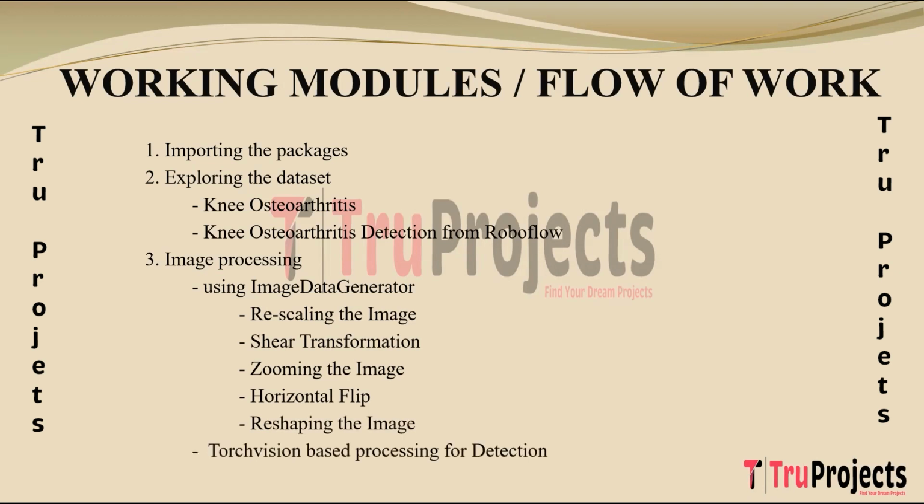Torchvision based processing for detection. Utilizing PyTorch's Torchvision library specifically for processing and preparing images to train the detection model. This step involves additional transformations or pre-processing specific to CenterNet model architecture or PyTorch requirements.